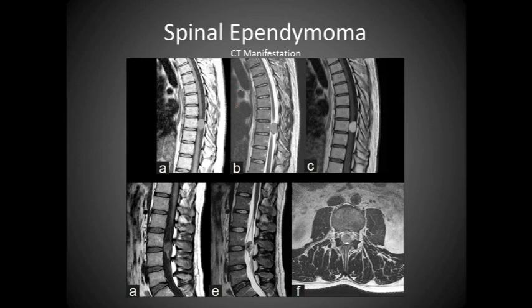So here you can see the spinal canal, and here we have this area, this rounded density inside the spinal canal. We can see it in all of these various planes and images. We have it right there, and so it's really impinging on the spinal cord as it's going down. So very important that this be remedied.